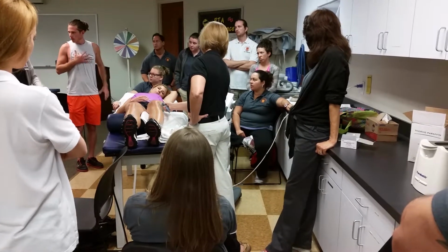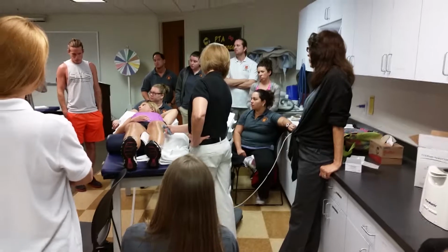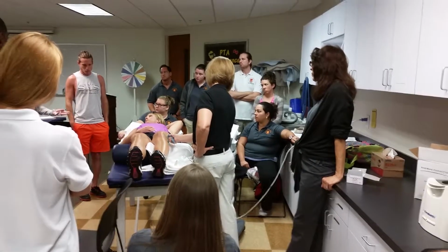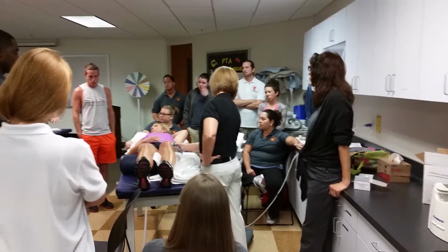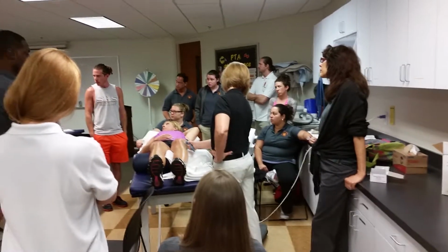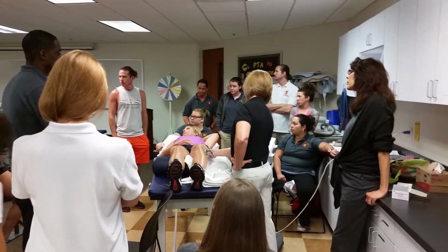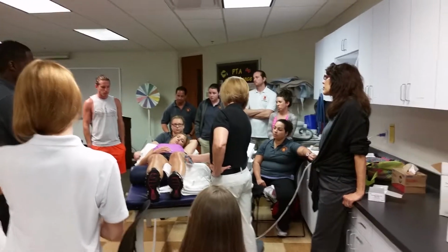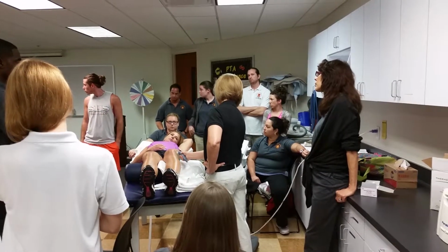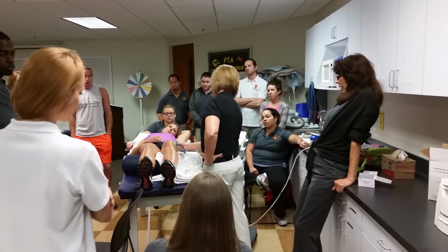Remember to use what you have for your body mechanics. If the table goes up and you're more comfortable with the table up, raise the table up. If you can sit, it's perfectly fine to sit. If you're doing an outpatient clinic, doing a lot of modalities, you want to make sure that you're not wasting your back. That really is key, because your arm gets tired when you're doing this, and that's when you get sloppy.